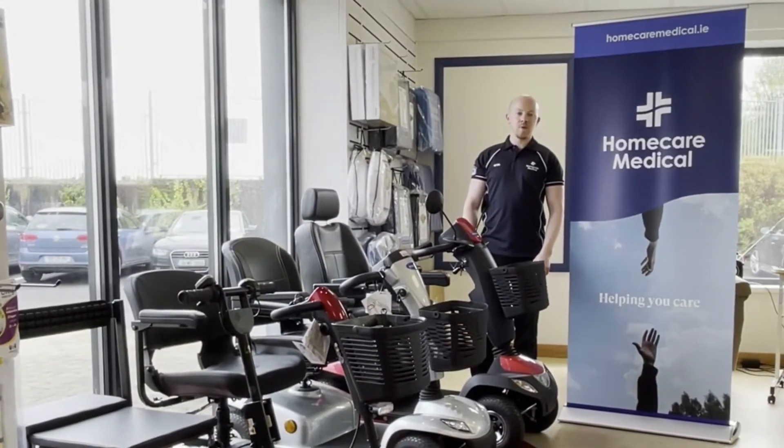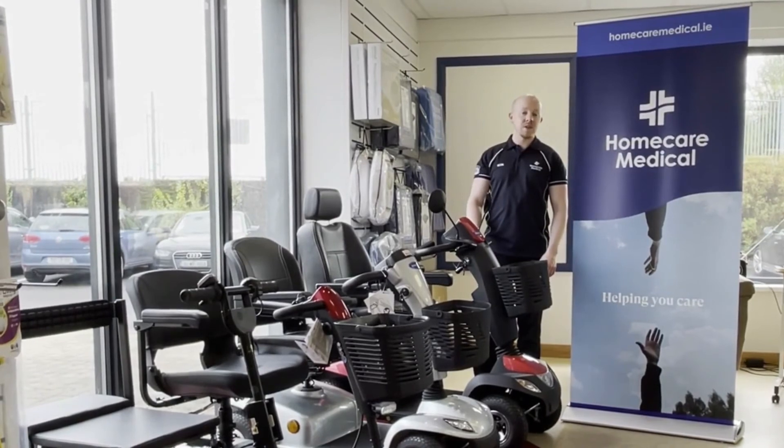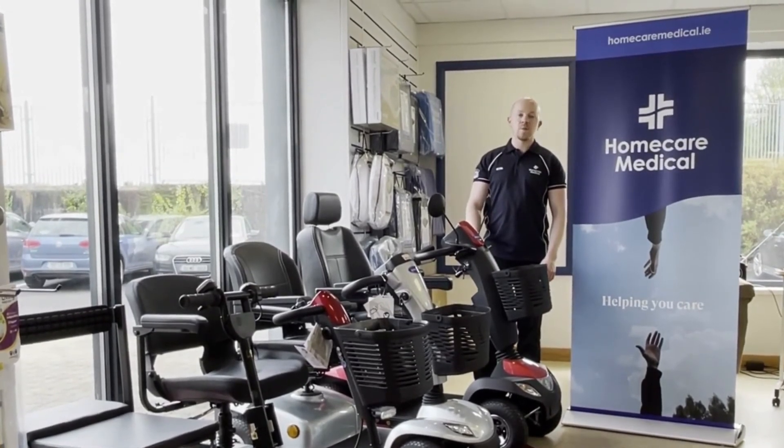If you're looking for a mobility scooter, you can view our entire range in any of our stores nationwide, or visit our website at homecaremedical.ie.